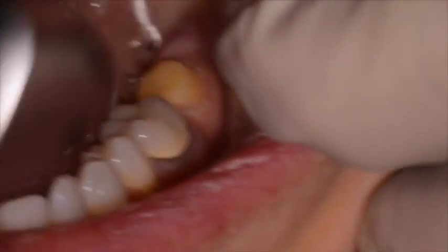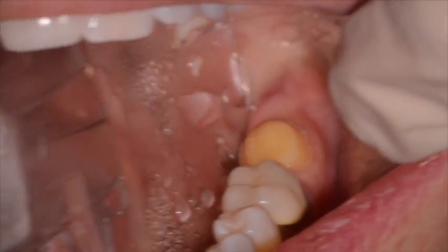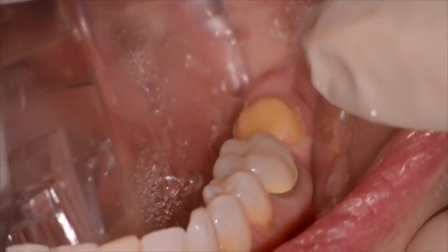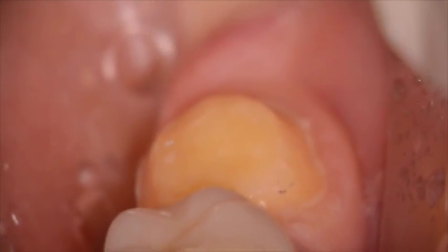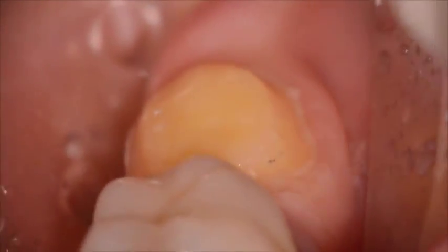You can see here in one easy step we're able to get off the fractured portion, be able to send it back to the lab so they can reuse it for a shade selection, and then fabricate the new crown. You can see here the entire surface of the fractured portion, and flipped over, the outer porcelain surface.